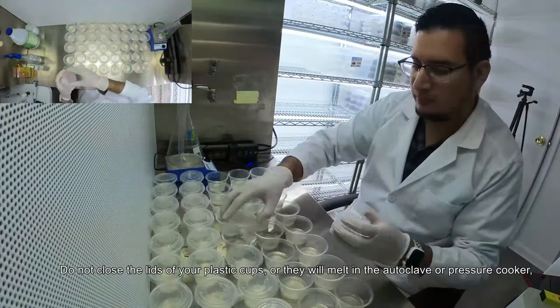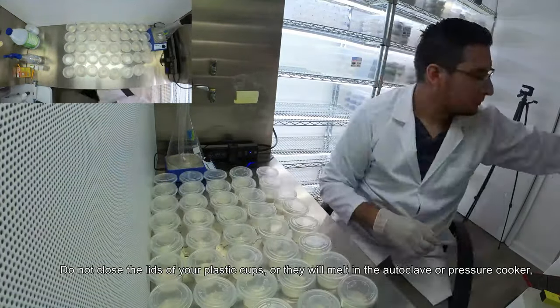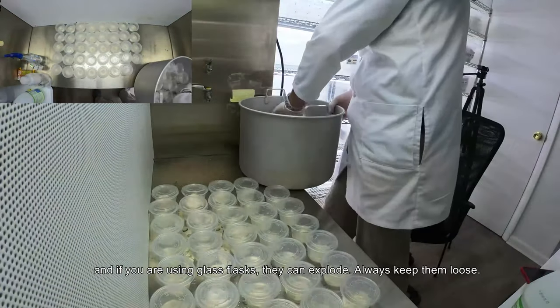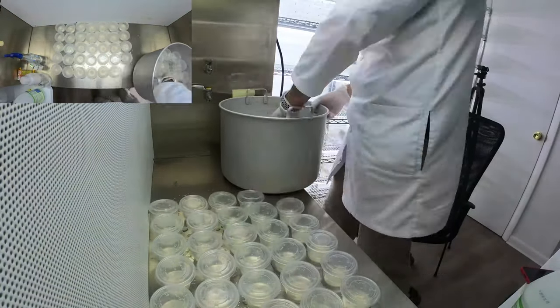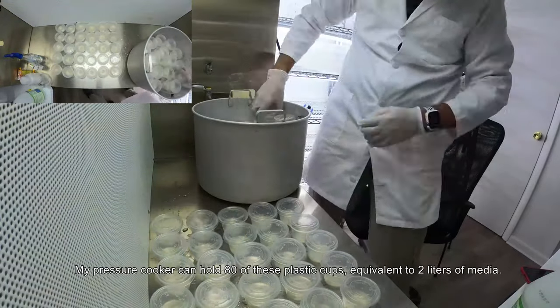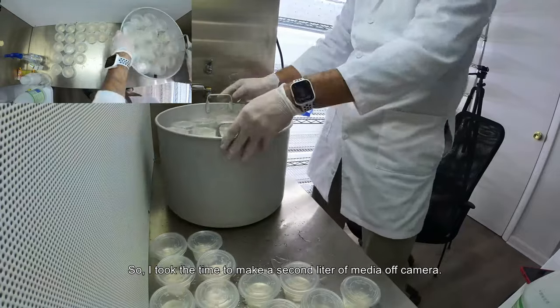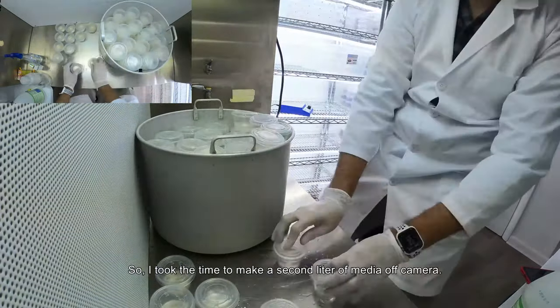Do not close the lid of your plastic cups or they will melt in the autoclave or pressure cooker. If you are using glass flasks, they can explode — I will keep them loose. My pressure cooker can hold 80 of these plastic cups, equivalent to 2 liters of media, so I took the time to make a second liter of media off camera.